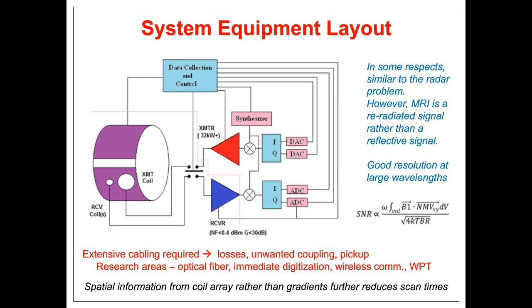And to the right, we have the equipment room, which, just by that name, is where a lot of the equipment takes place. So if we have a transmit coil, that excites the spins, and then the receive coils pick up and go to a typical receiver. You have to have some sort of transmit-receive control because in many cases the transmit and receive coils are the same antenna, quote unquote. Then you could go to standard low-noise amplifiers.